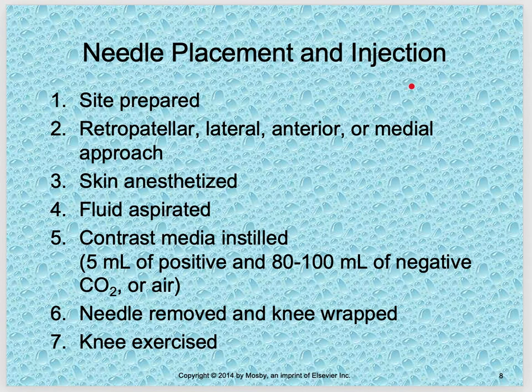So needle placement and injection, so prepare the site. Retropatellar, lateral, anterior, or medial approach. So all of these approaches here are viable approaches. It just depends on what the radiologist uses and which way he's going to go. So make sure that you know your radiologist and know his approach so you can set it up appropriately.